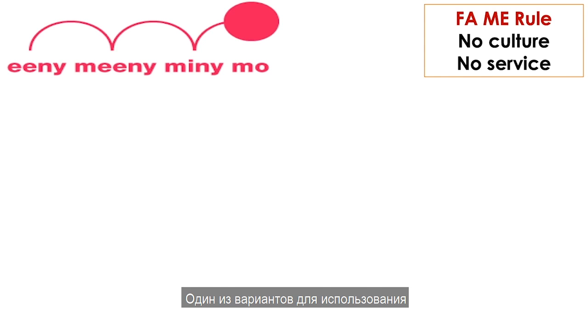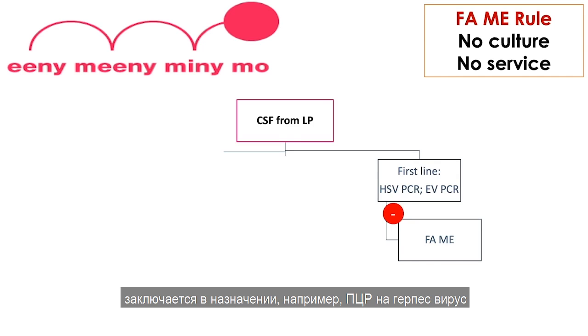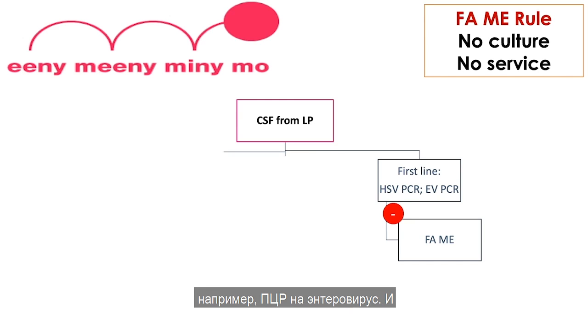One option for offering the panel, and some places may be doing this, is to offer an HSV PCR or maybe a single target enterovirus PCR first, and if negative, reflex to the FilmArray panel. But one limitation of this is the turnaround. You're just delaying turnaround time by offering another test first. And if you're only performing the other test once a day, that just delays it even further.